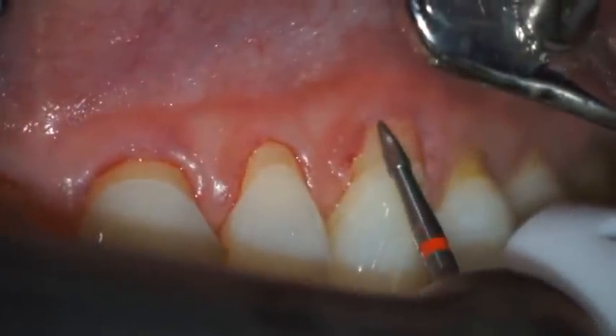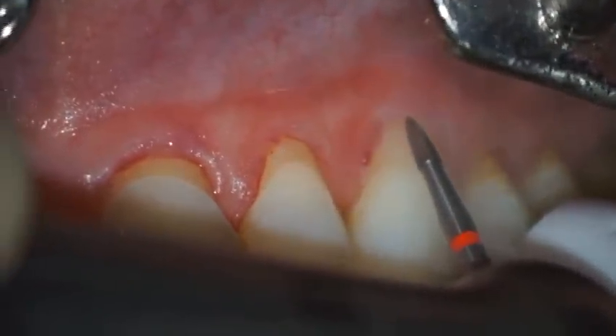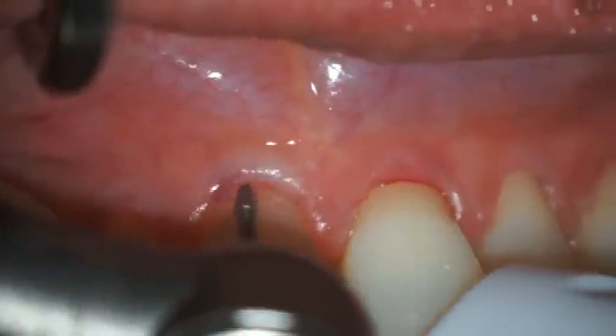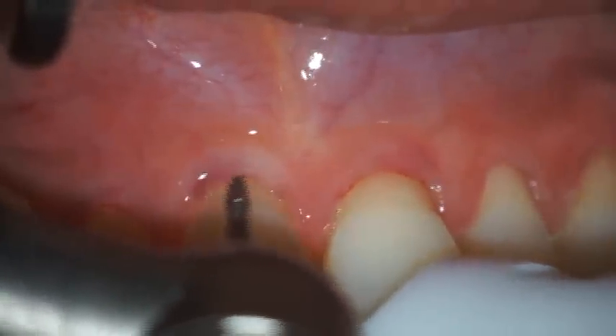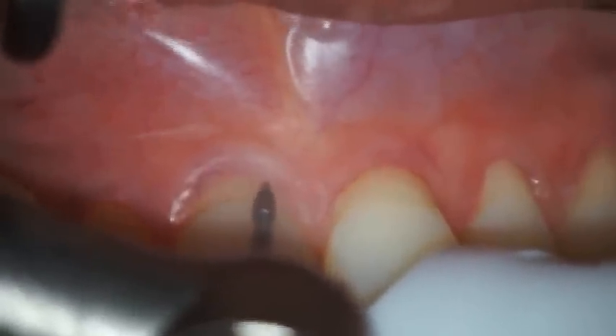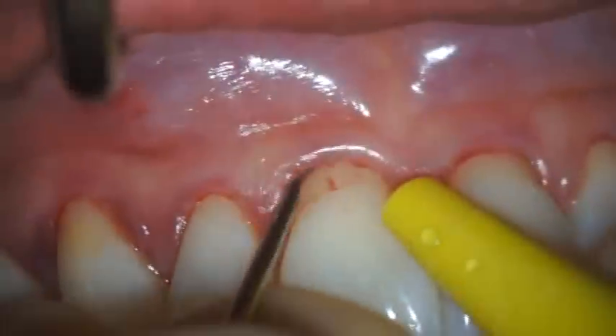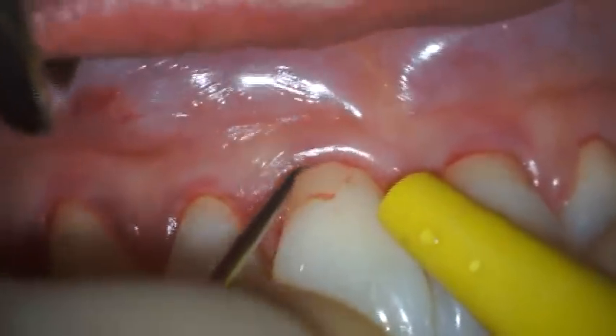A rotary finishing burr is then used to initiate odontoplasties in order to reduce the profile of each exposed root surface, improving the chances for successful root coverage. The goal is also to make each root surface as smooth as possible. Root preparation is completed using manual root planing.